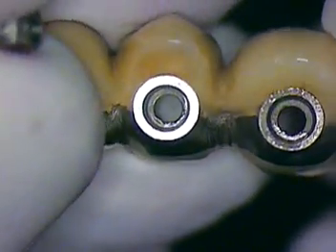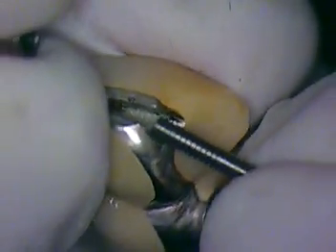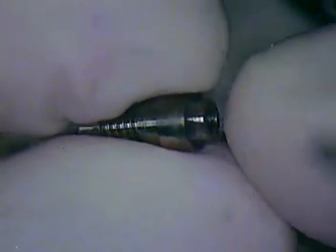You can see we had to ream out that other one to get the diameter identical, so there we are. We're bottomed out all the way. The only thing that we don't know as much about is our friend right here, so we'll be seeing that in the mouth. Right now, this is going to get tightened down back in the mouth. That's the IMC on number 20.